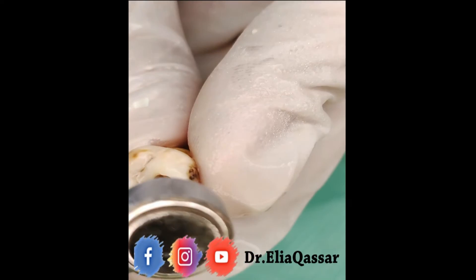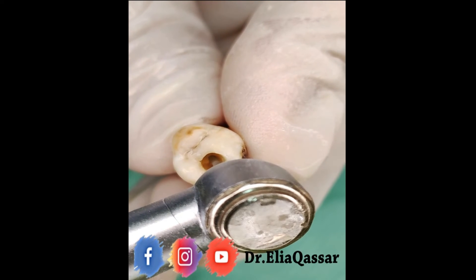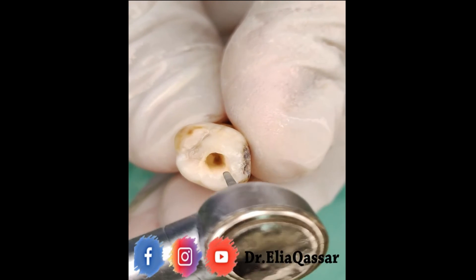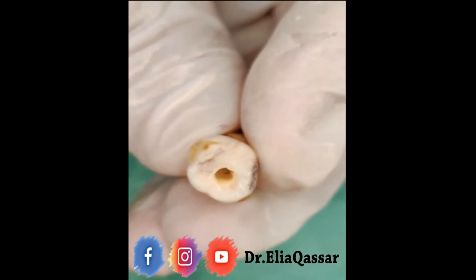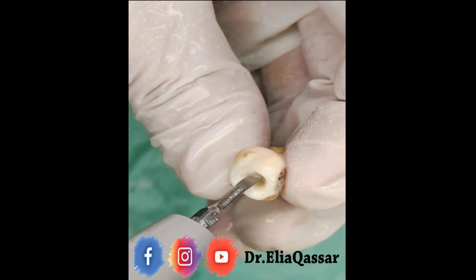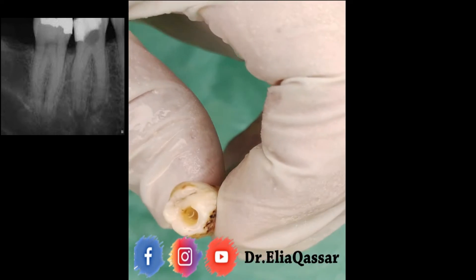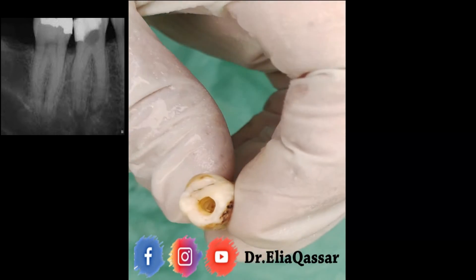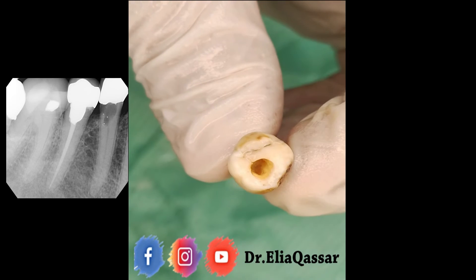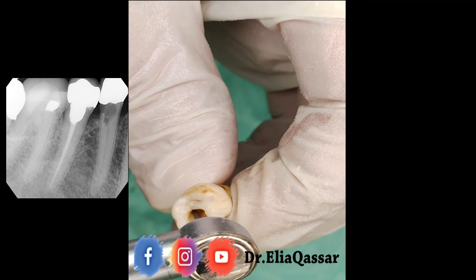Sometimes you may face a calcified pulp chamber. In these cases I recommend using a periapical x-ray to find out exactly where to prepare. As you see in the x-ray on the left side, it helps guide your access preparation precisely.